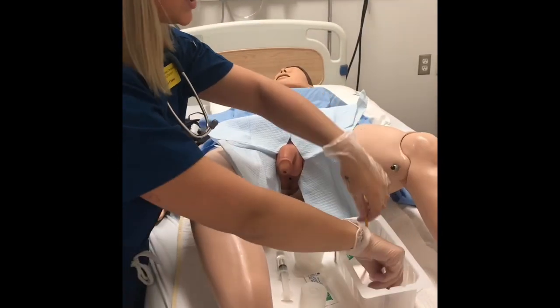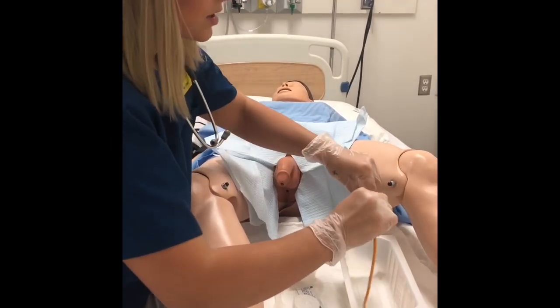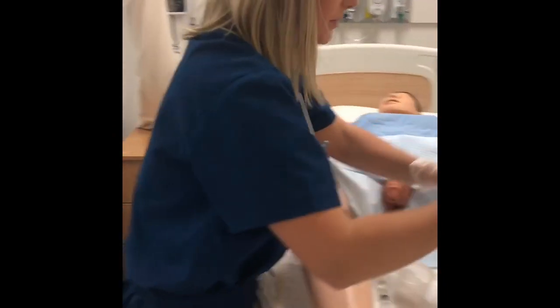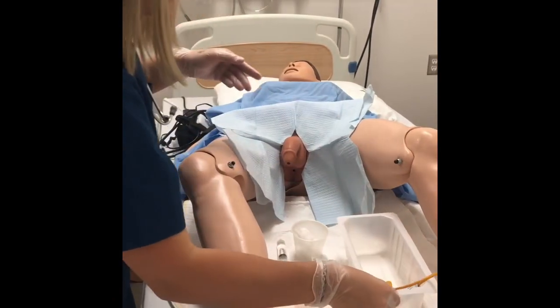And I'm just going to put the end of the catheter into the lubricant so it is ready when I need it. So I'm sticking it all the way down to the bottom, and I'm just going to leave it in there until I'm ready for it.